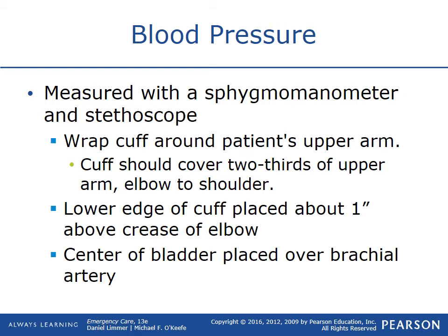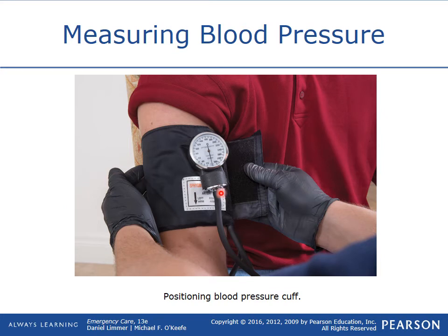On those blood pressure cuffs, they'll have an arrow saying line up on the artery here, but the center of that bladder should be right over that brachial artery. As you see here, the cuff, as the artery would come down the brachial side and a little wrap around the arm there, you get this arrow lined up on the arm right there, right where your vessel would be. And it's just generally velcroed on and put in a spot where you can have this gauge visible. Now also, most blood pressure cuffs, these gauges will come released off of there if you just want to take that and unclip it off, lay it on your lap, whatever, if it just works a little bit easier for you to see it that way.